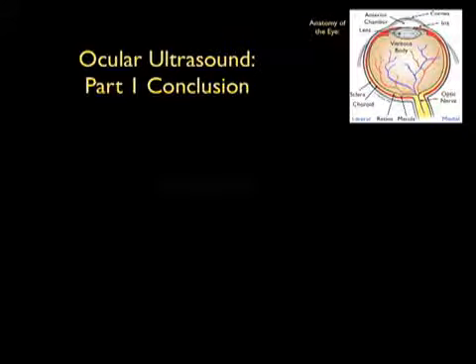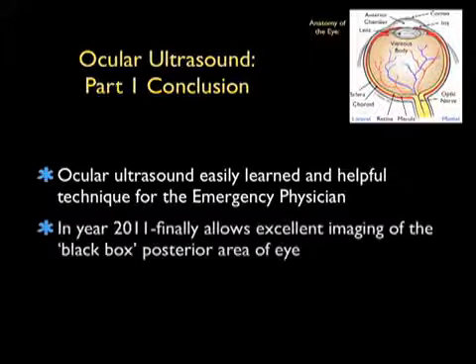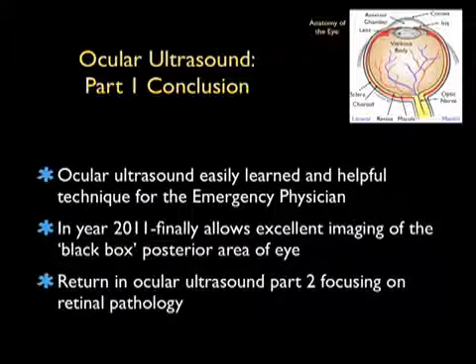In conclusion, thanks for tuning in to part 1 of Ocular Ultrasound. I hope I've been able to drive home the point through this module that ocular ultrasound is an easily learned and very helpful technique for the emergency physician, and in the year 2011 finally allows excellent imaging of that black box posterior area of the eye.